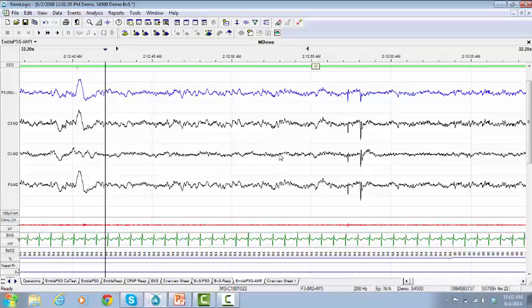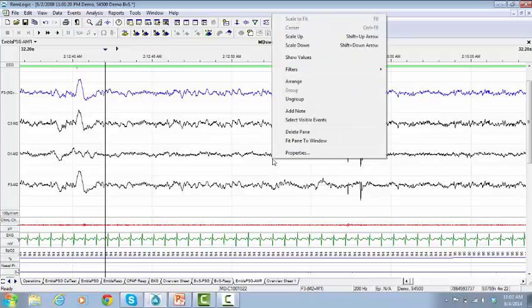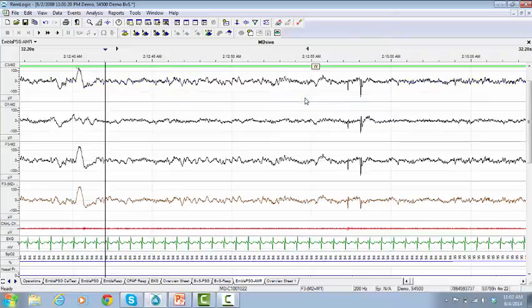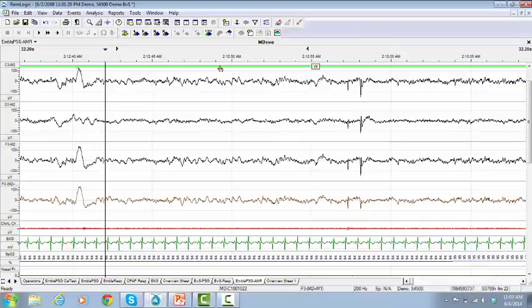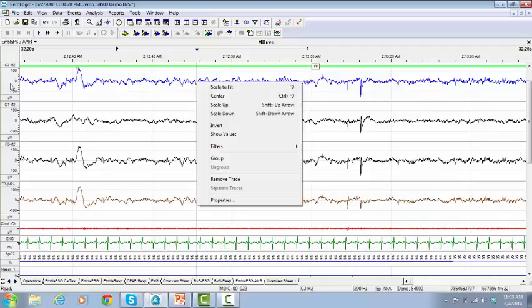All signals will be scaled together. For example, if you want to identify the amplitudes for the EEG signals so it will be easy to identify delta activity, press right-click and click on Ungroup. Activate a trace from the EEG, then click on the amplitude axis, which is located on the left side of the pane.